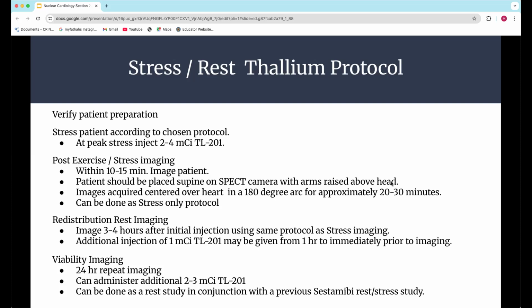Now, when you have your camera in L mode, and you've got your patient in there, right here, you're getting a really good septal view. And right here, you're getting a good anterior view, right? So we've started already getting a good septal and anterior. And by the time this goes around 180 degrees, we now have a really good inferior view, and we've multiplied our anterior view again, right? So you've got multiple views. What we avoid is coming around on the right side of the patient. And again, because we're not going to really image the heart much from the right.